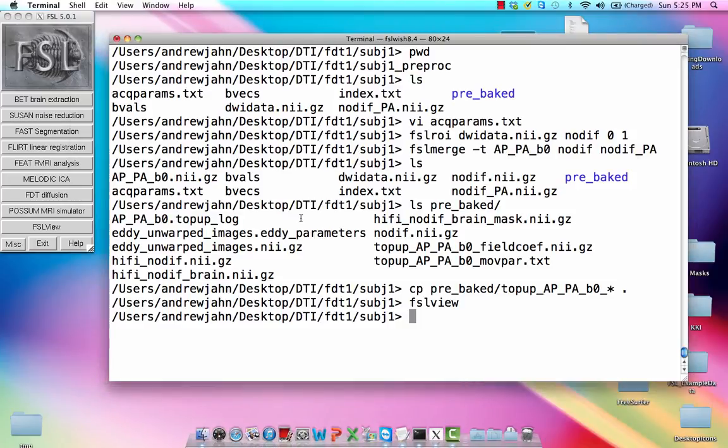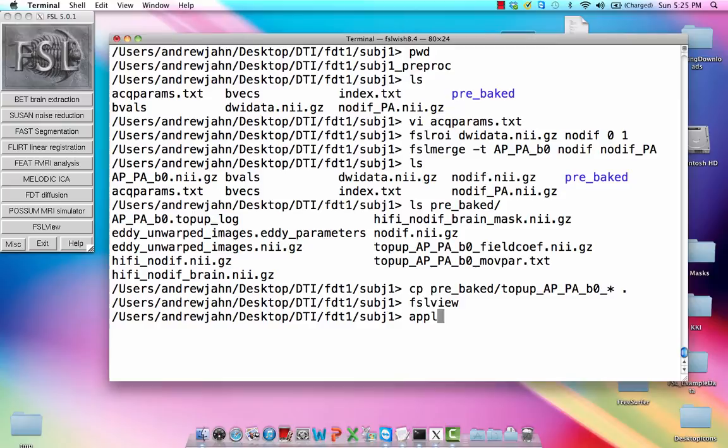So lastly, now that we have that, we have what we need to go forward and just run the eddy correction, which is kind of like a motion correction step. But just to show you how this has affected our data, how it has corrected for some of the distortions, I'm going to run the apply top-up command.